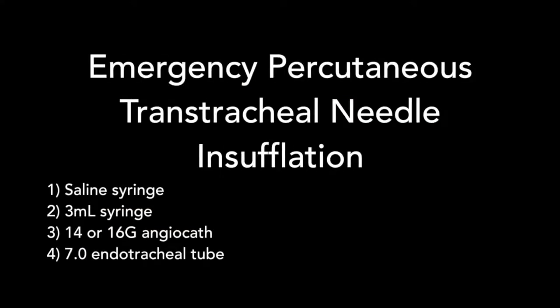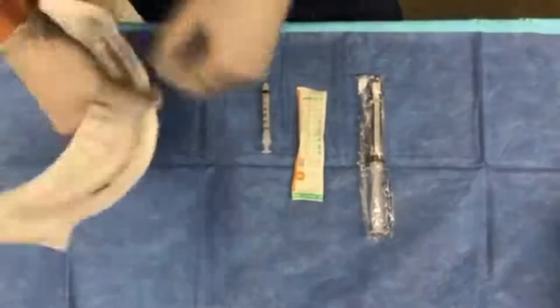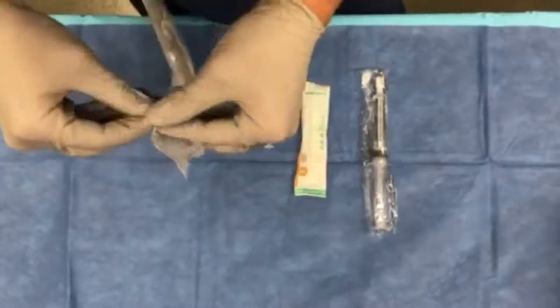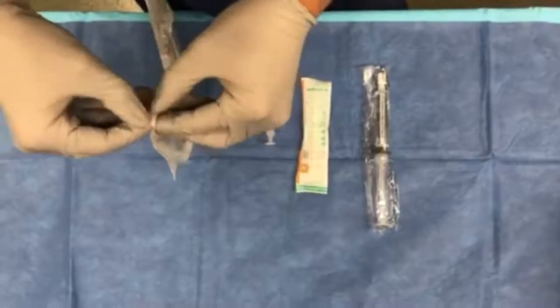In case of emergency, such as laryngospasm and the inability to ventilate a patient, a percutaneous transtracheal needle insufflation device can be created with the following materials. The video shows how to assemble these to have them ready on the back table in case of such emergency.